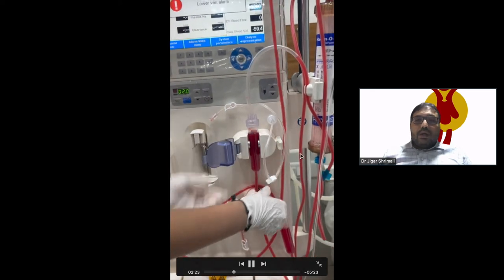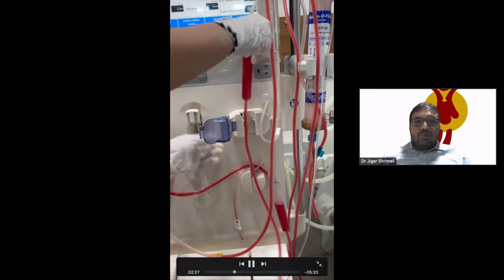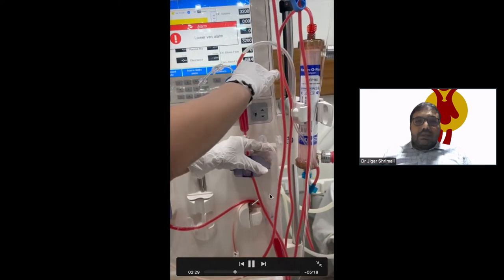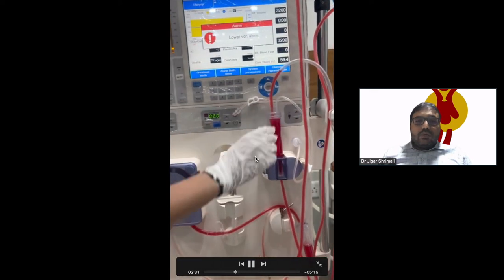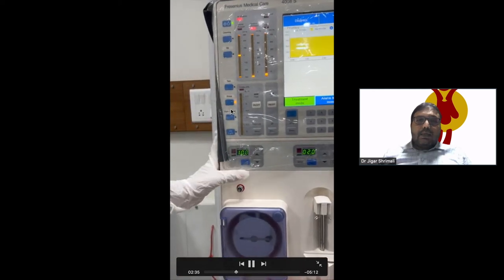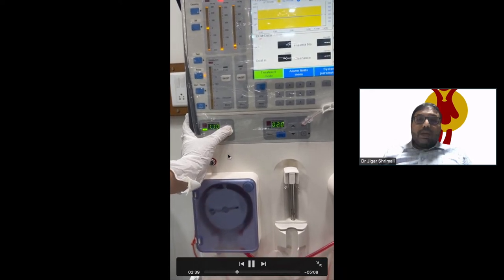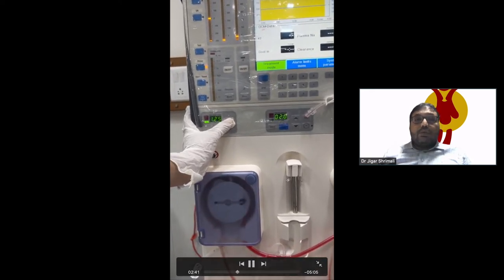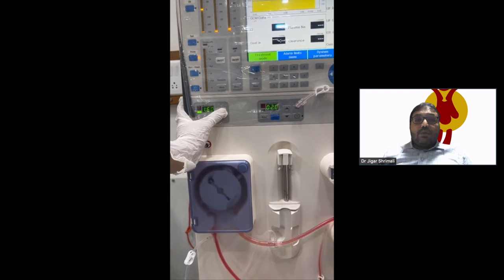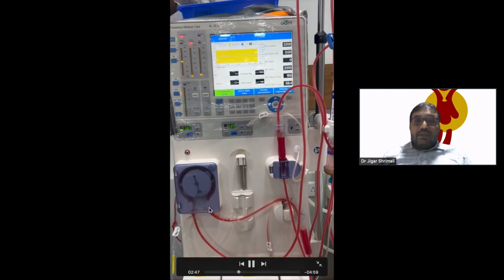Now we check the venous pressure line. The venous chamber and venous line are removed from the air detection alarm and venous clamp. After that, we put the machine into prime mode. In prime mode, it will start. The machine will trigger the air detection alarm, and the venous clamp will not open and the pump will not run.